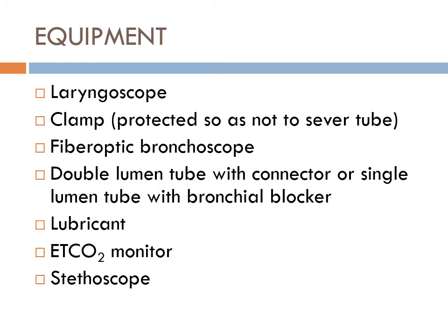If you go in with a bronchoscope and your image is bad because you've got secretions or something on it, one other thing you can do with the scope, which works really well, is gently touch the mucosa of the trachea or the bronchus, and that will usually clean your scope. Just touch it, come back, get your view.